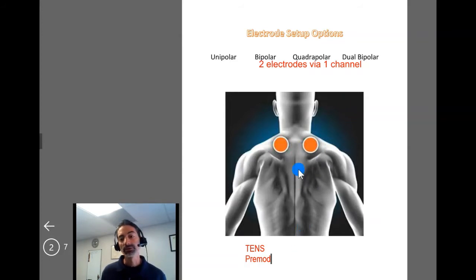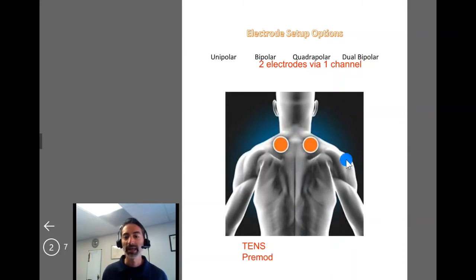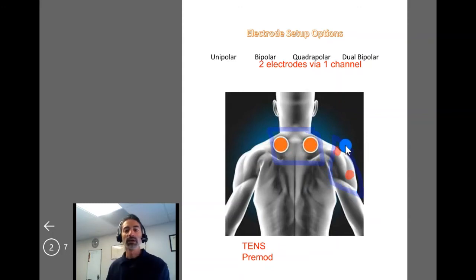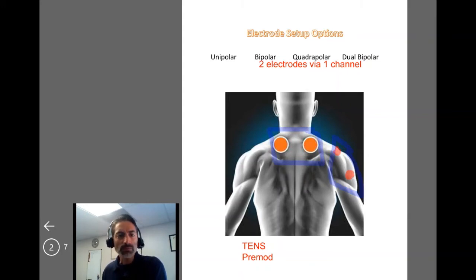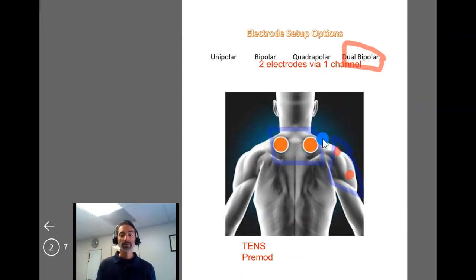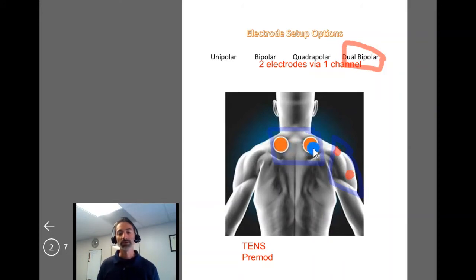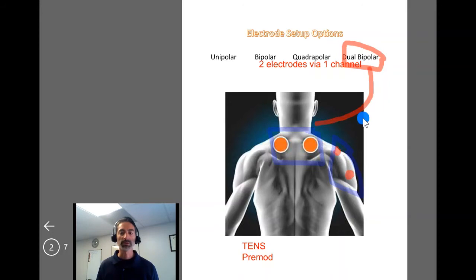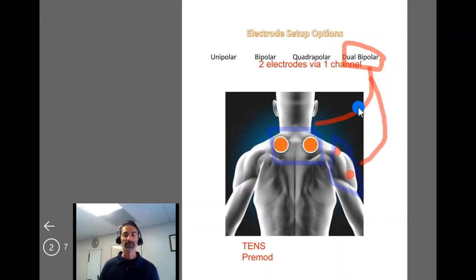Now, let's say the patient also had right shoulder pain in addition to cervical pain. In this case, you could have one channel focusing on the cervical spine and a second channel focusing on the shoulder. This would be called dual bipolar — two channels, channel one and channel two — each with separate parameters and settings. You'd turn up the intensity for the cervical spine separately from the intensity for the shoulder. It's dual bipolar when you have two independent channels that are not necessarily connected.